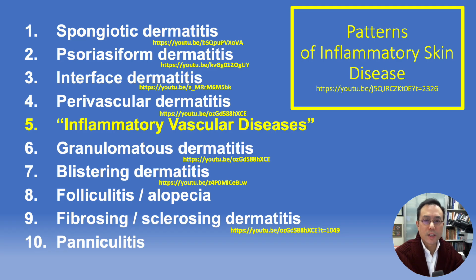This session will focus on vasculitis and related disorders such as vasculopathy under the broader heading of inflammatory vascular diseases.